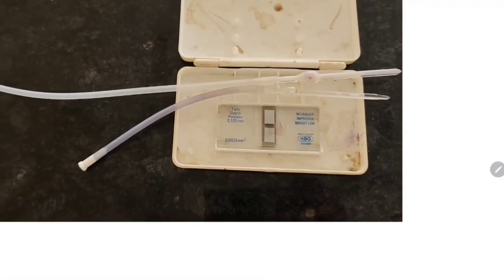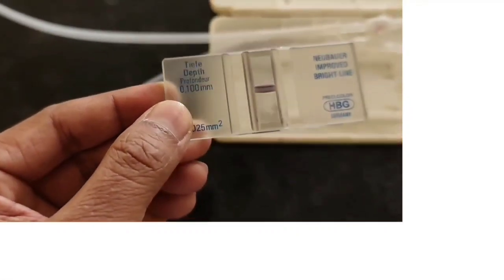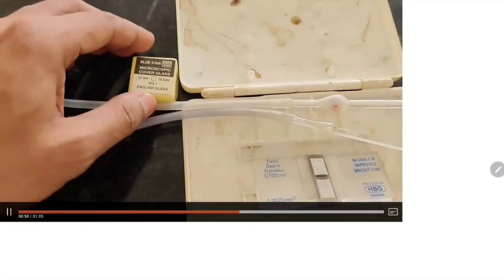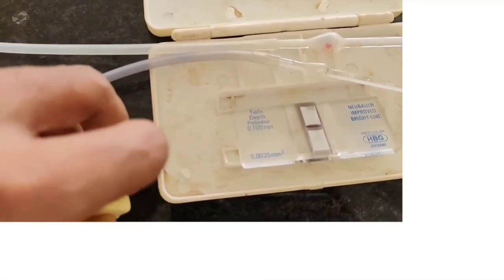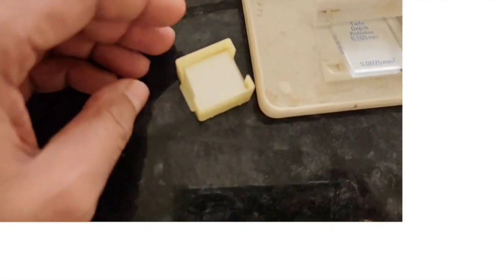And the improved Neubauer slide. This is a very thick slide, called the improved Neubauer slide. And next we are going to show you the cover slip. This is the cover slip which is used to cover that glass slide. Which glass slide? The Neubauer slide.